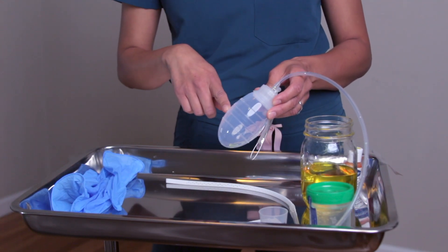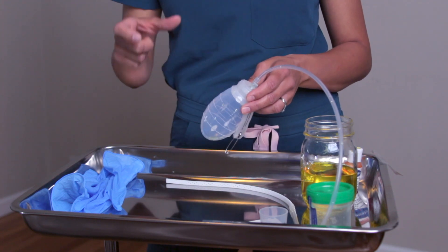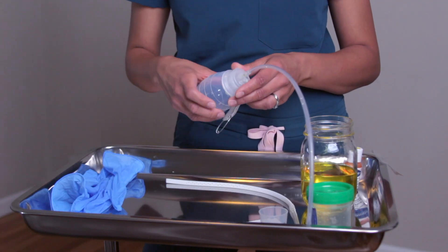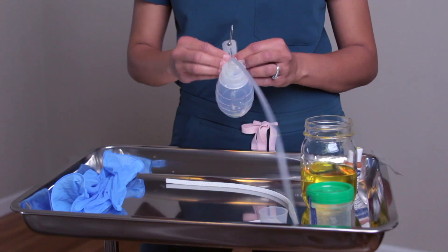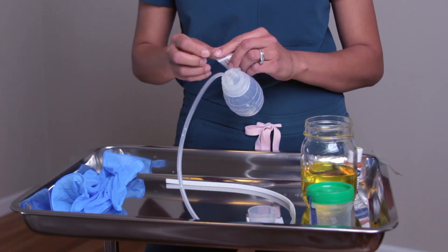I don't really go by the measurements on the bulb itself. What I go by is using a sterile specimen cup or a medicine cup to help measure my fluid output. You also have your hang ring, which is attached to a safety pin.